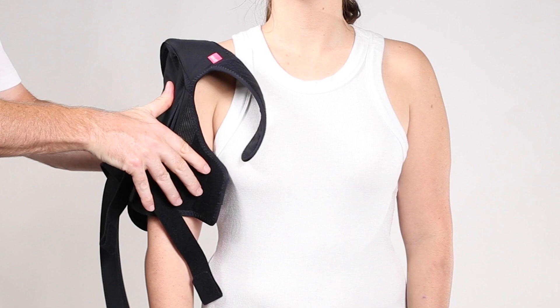Start by opening the cross strap and all the circumferential straps, then open the main closure panel, drape the brace over the shoulder, and secure the main closure panel around the humerus.